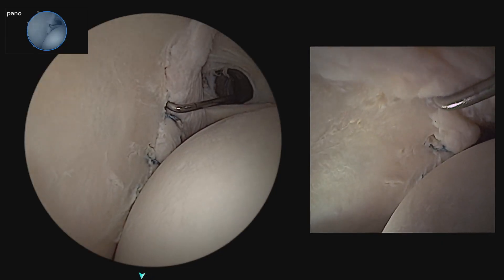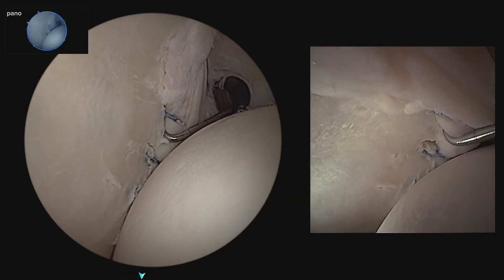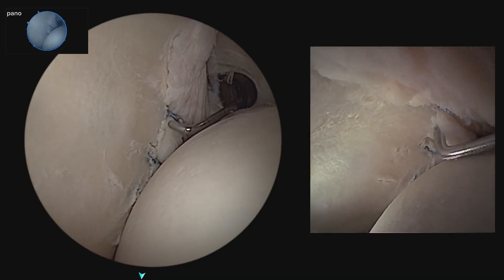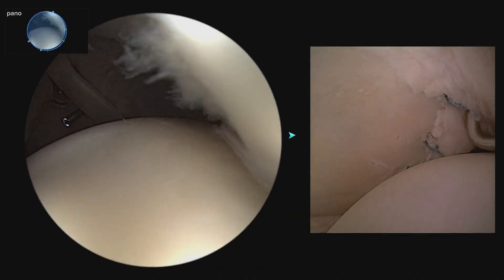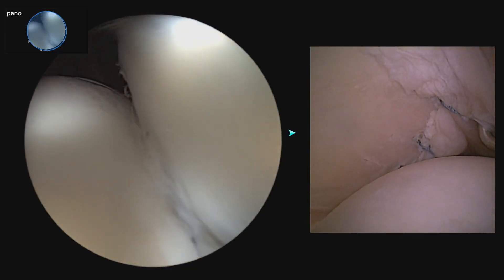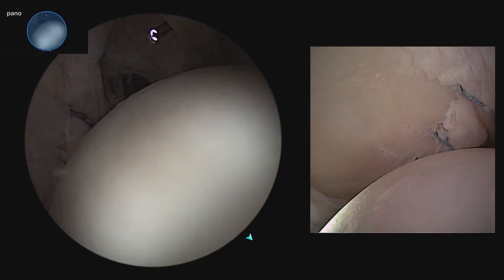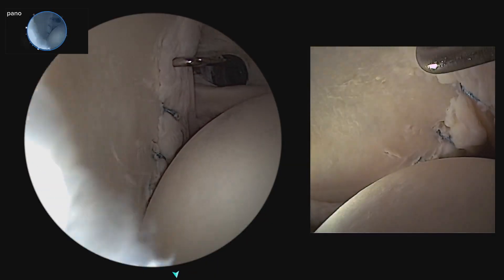After final tensioning, we have an excellent repair of the anterior labral tear with good re-approximation of the labrum back onto the glenoid surface. We can visualize our remplissage with the infraspinatus fully filling the Hill-Sachs defect — unable to even see any of the Hill-Sachs lesion anymore. This dual view was only made possible with the Synergy Vision system.